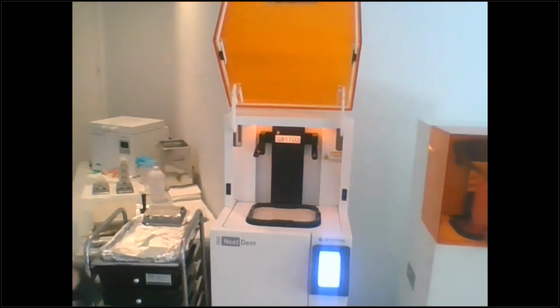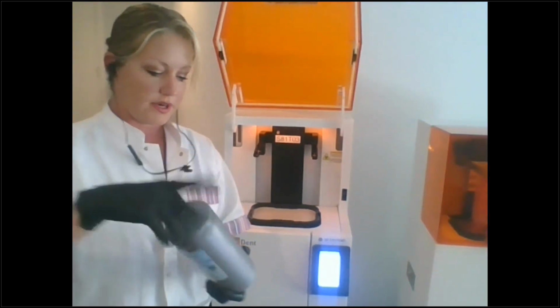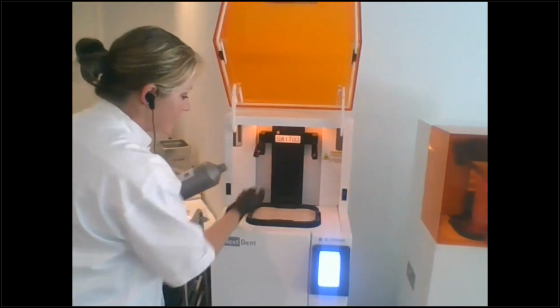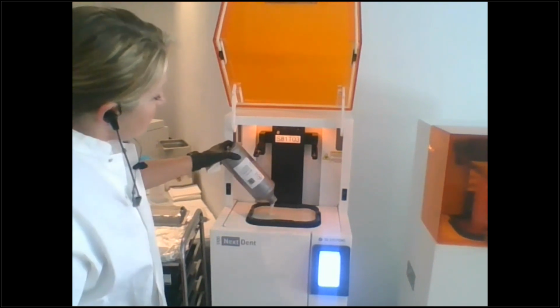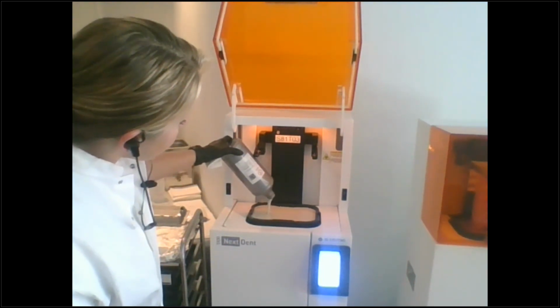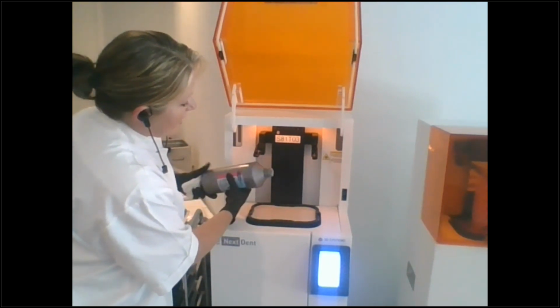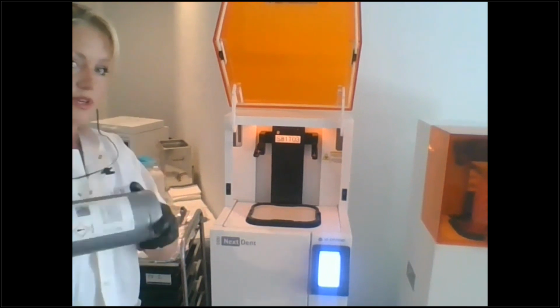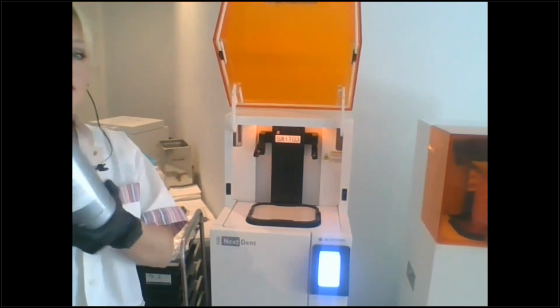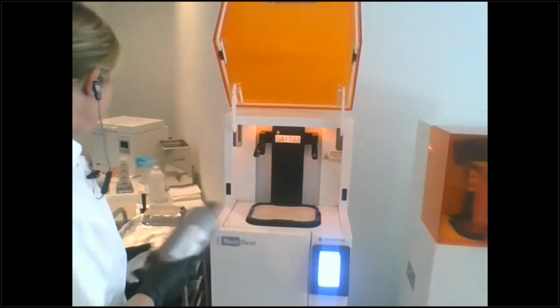Okay, so I've got my mixer mixing, and I have 2 bottles on here. I'm going to go ahead and pour all the way up to the max line. Each line is 100 grams. And when you pour, then just do a little twist there, and that'll stop the rest of that resin from coming down your bottle. You want to keep that clean because when you put it on the mixer, it's mixing around. You don't want to mess up your barcodes with resin because you were messy.